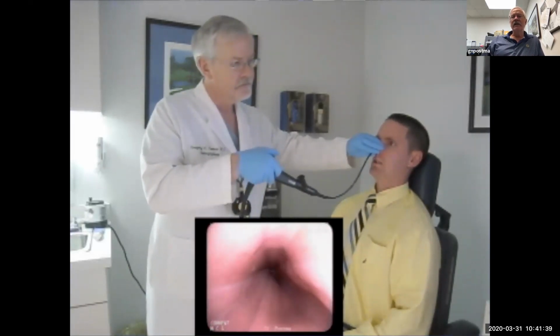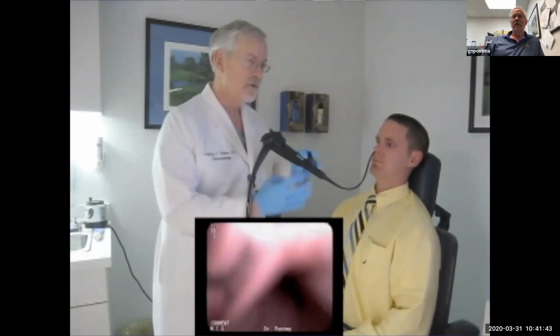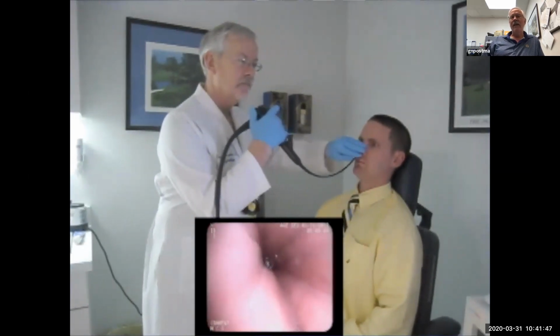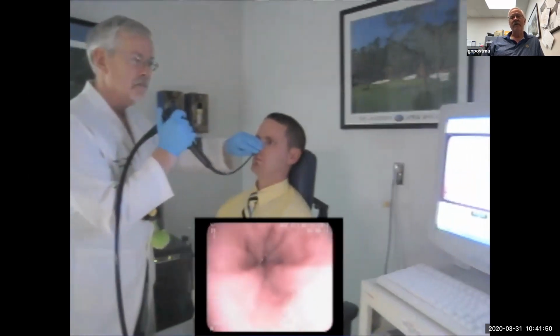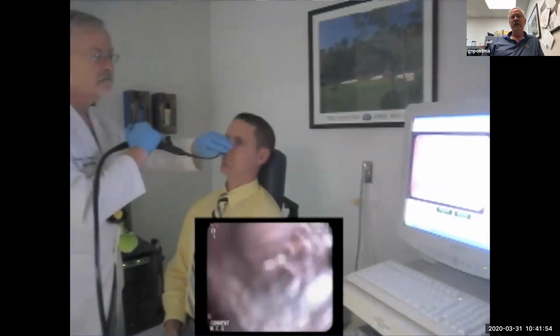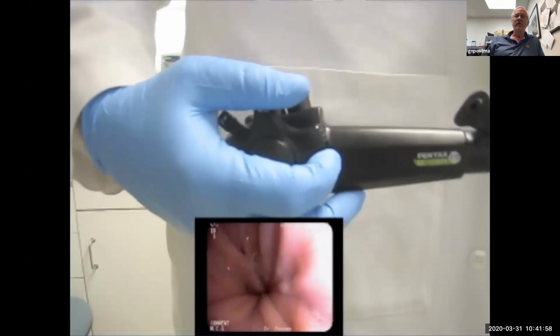So I like to look, the endoscope centers itself on the way out. So I tend to do most of my looking on the way in. You notice I start with a fishing pole, but a lot of people prefer to hold it like a GI doctor. I don't care how you hold it, as long as you can steer it. You steer both with your backhand as well as the hand on the scope. It's a single wheel.